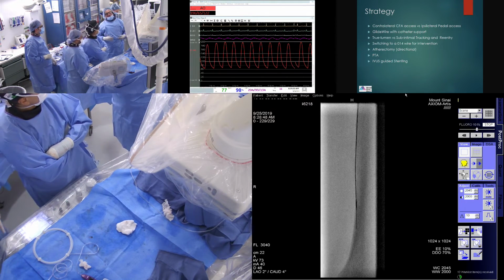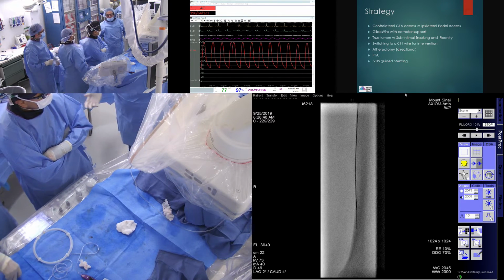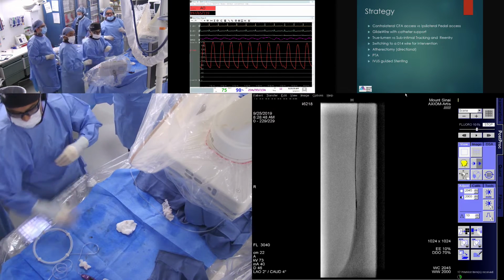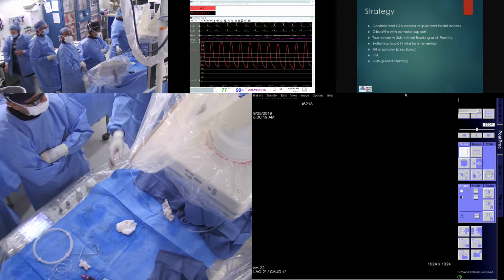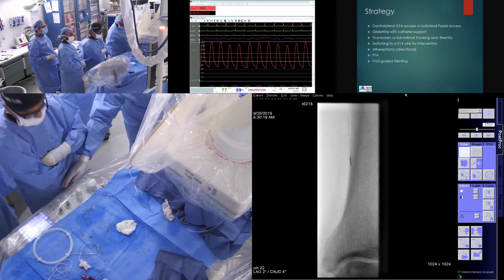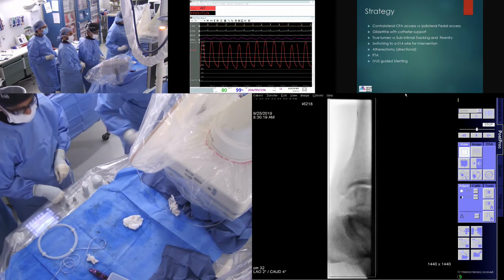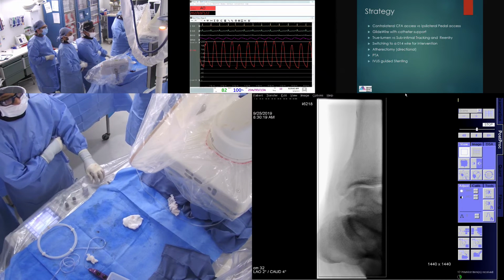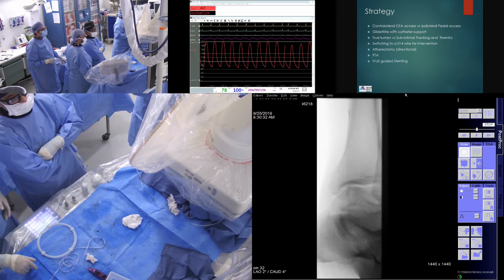And then all of a sudden, a year and a half, 2 years later, when he progresses, you go to bypass, we do an angio, and nothing is open. So I can't imagine that if I don't traumatize the distal vessel where you can target, it's going to get any worse. I'm not sure. I don't know how you evaluate that, but I think that's a discussion that needs to be had with the vascular surgeon and the patient, illustrating our multidisciplinary approach on this.